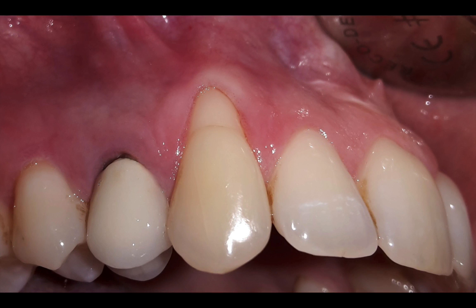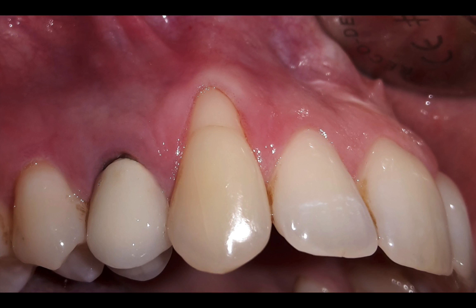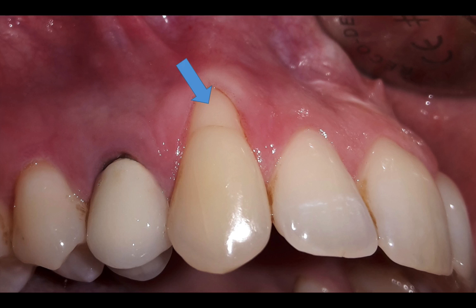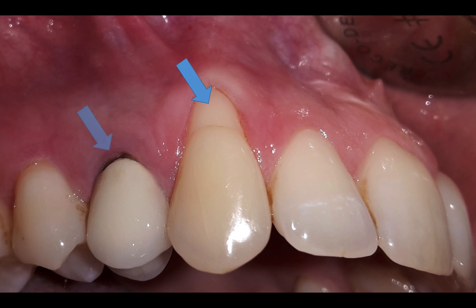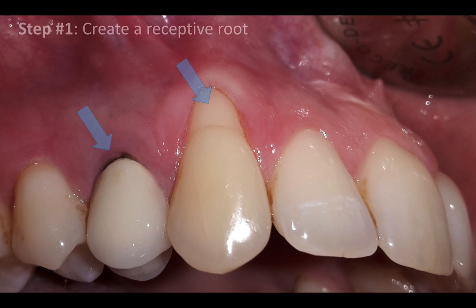The goal of part two of the video is to give you an idea about the sequence for a connective tissue graft treating the canine, but also the premolar next door.